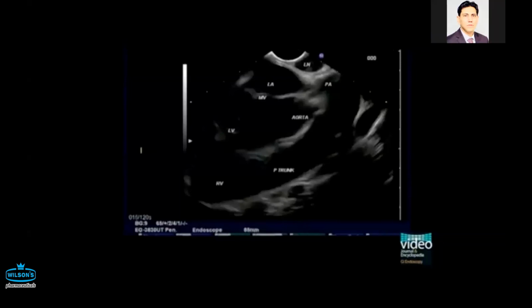No, I think that's a very valid point, especially when you are withdrawing the scope and if your elevator has to be in a neutral position, because that could also cause trauma. And lastly, just one quick thing, as Khalid Bhai had said during previous sessions with the hepatic vessels, especially with that smooth muscle wall, you get this bouncing off phenomenon, which also alerts you that you're going in the wrong territory. But otherwise, absolutely fantastic.